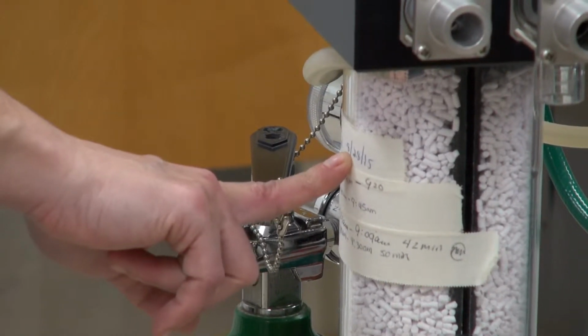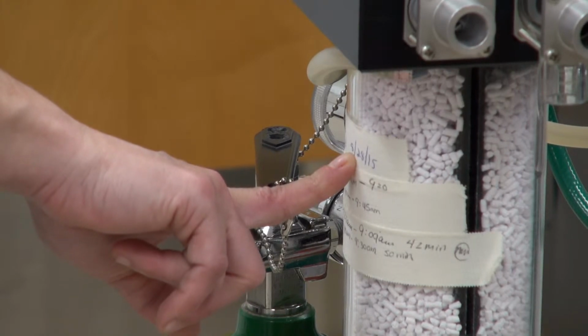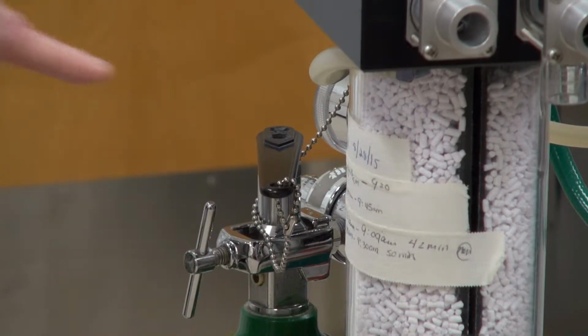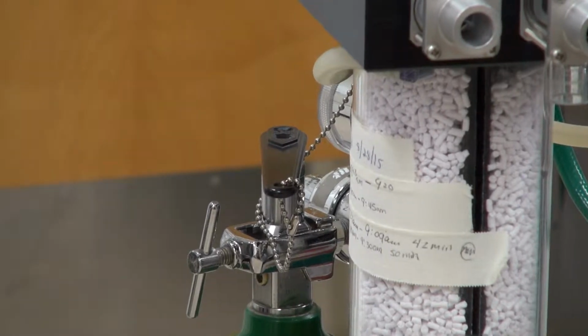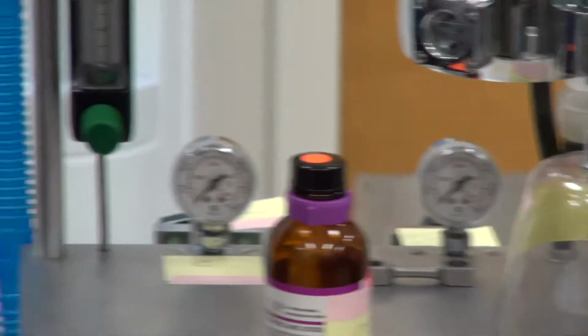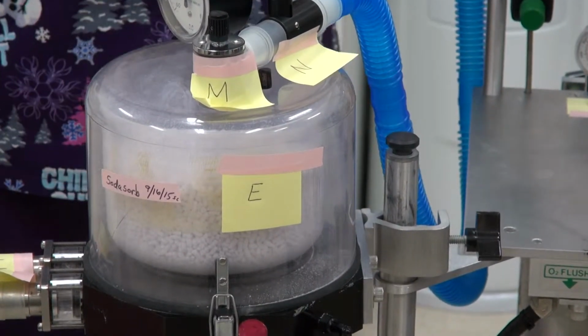Usually, what did I say? How often are we changing our soda lime? About every what? 2 weeks, right? Depending on how many procedures we do. So you're always checking the color. What color is going to tell me that I need to start changing my soda lime? Purple, correct. Okay.